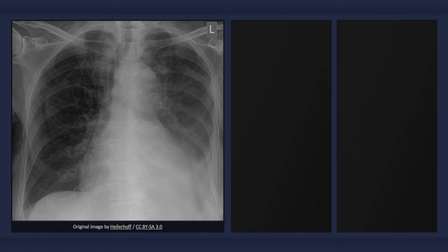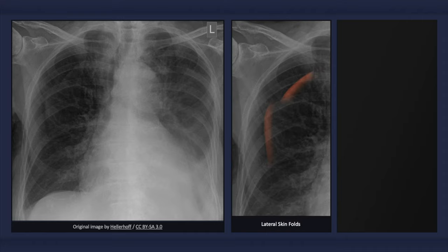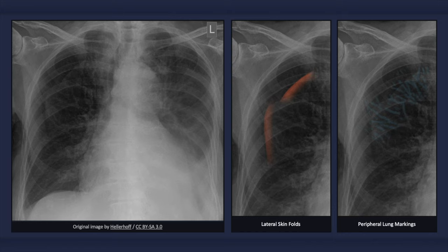A skinfold on the chest can result in an abrupt drop-off in opacity, thereby mimicking the radiographic findings of a pneumothorax. A skinfold, however, has a dark band — as opposed to a light line — at its lateral contour. In the case of skinfolds, bronchovesicular markings extend to the periphery of the lung, whereas with a pneumothorax they do not. Keep in mind, however, that apical bronchovesicular markings may be difficult to appreciate.